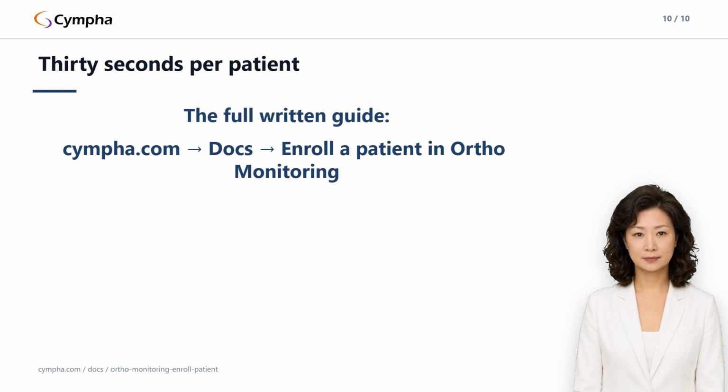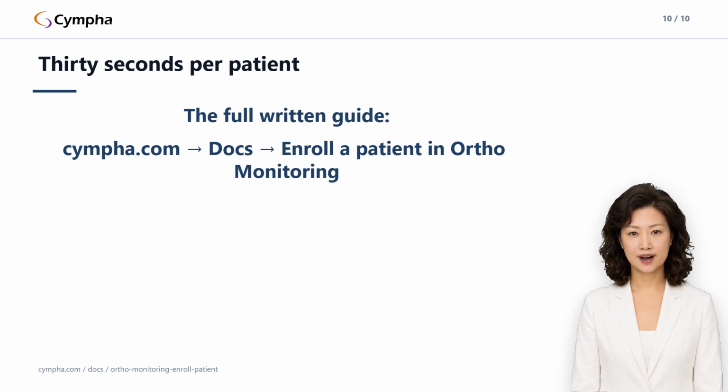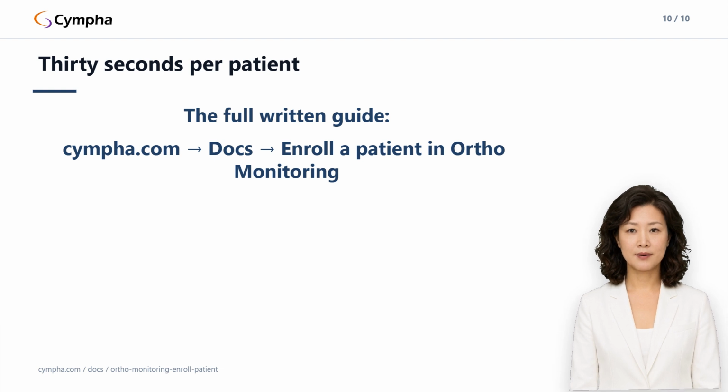If you haven't watched the treatment plan sharing lecture, it pairs naturally with this one, same button, different destination, and the docs also link a deeper cookbook on the doctor side 3D playback experience when you're ready to go further. Everything from today, every prompt the patient sees, every check for the first round, is written out at cympha.com. Open the doc section and find how to enroll a patient in ortho monitoring.